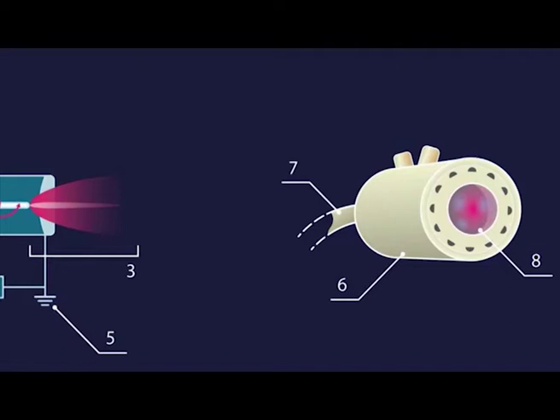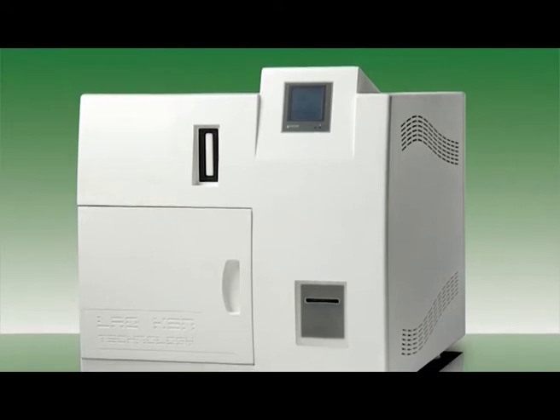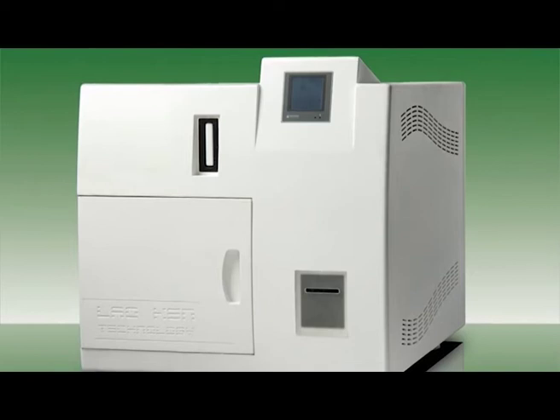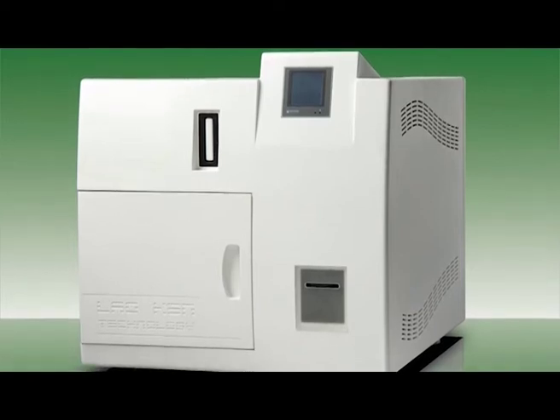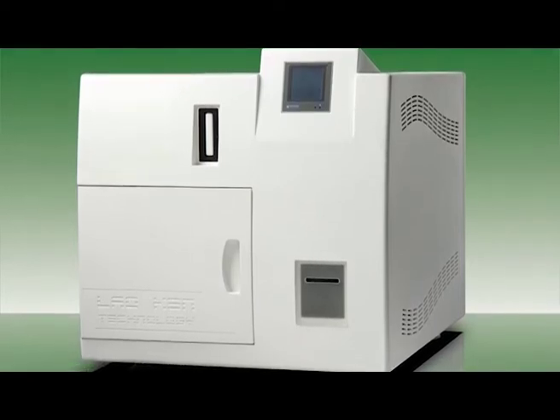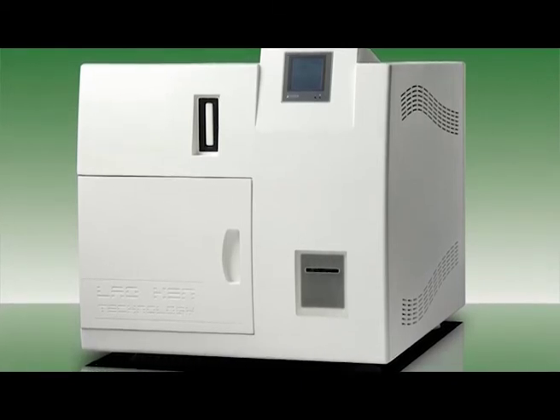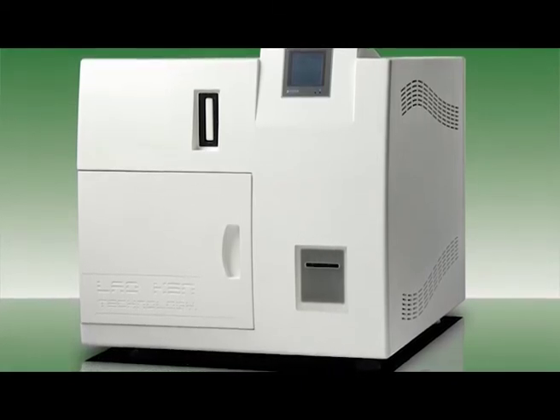The plasma sterilization is a dry sterilization process. All sterilization processes are carried out in modern machines with controlled parameters and written records providing details of the sterilization processes. All sterilization processes are rigidly monitored by both chemical and biological indicators.